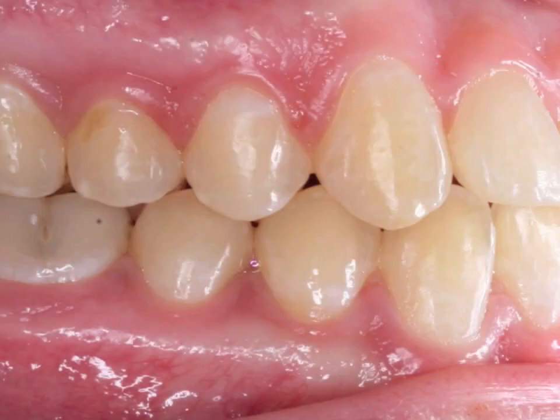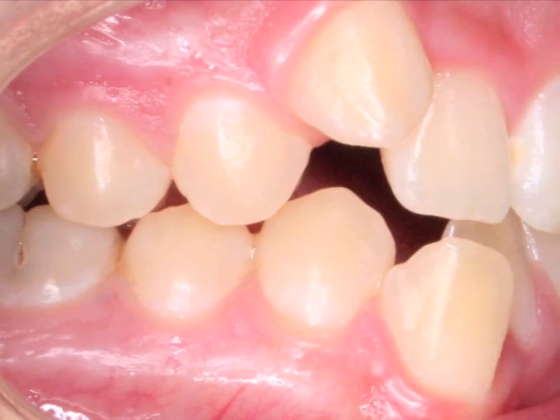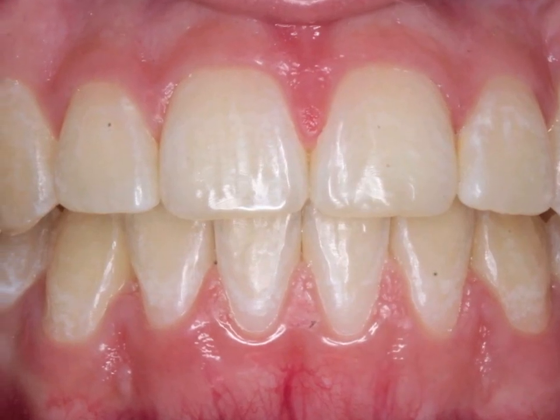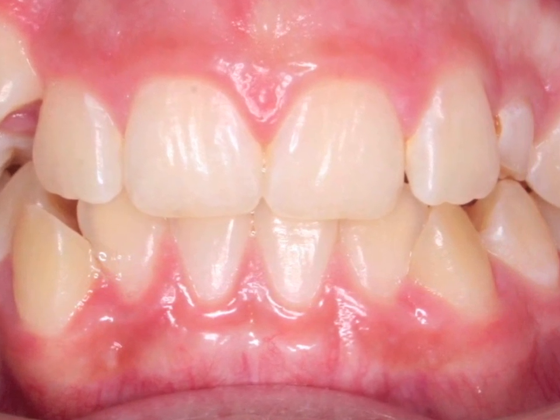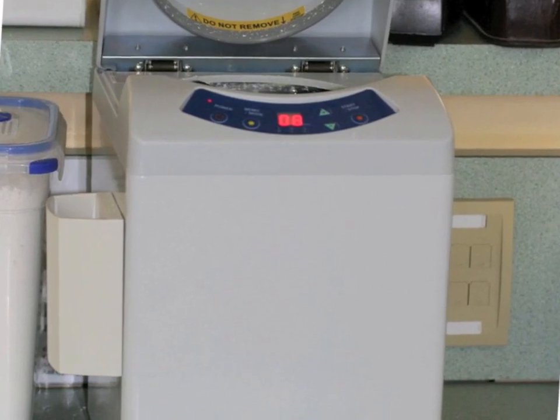The importance of precision bracket placement is based on several principles that will be outlined in this video. The tip of the first bicuspid will approximate the edge of the central incisor, as first described by Dr. Kalanji. These before and after photos are a result of that placement technique. Sometimes we adjust incisal edges prior to impressions to allow more accurate bracket placement.